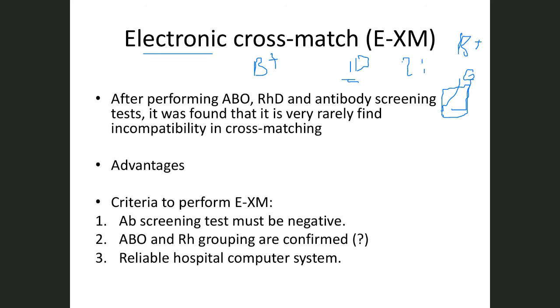However, to my knowledge, they do cross matching. In some countries, just like for example yours, they do cross matching. However, some give me one electronic thing.